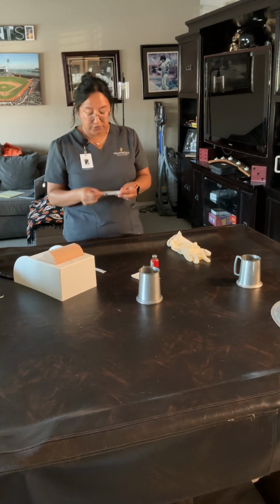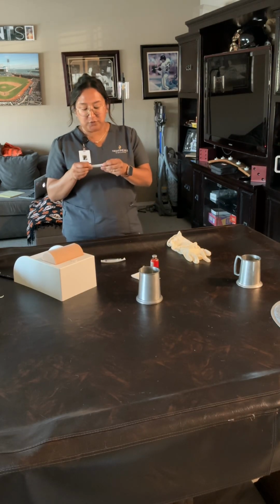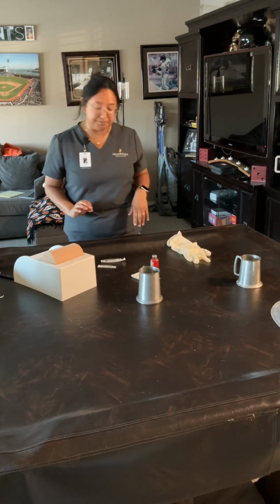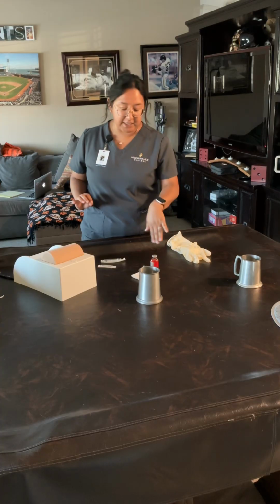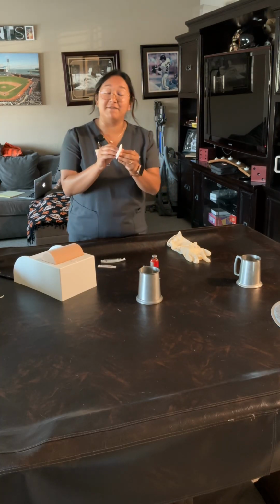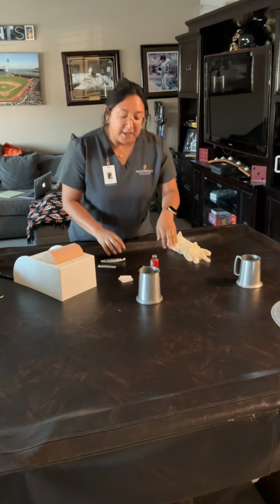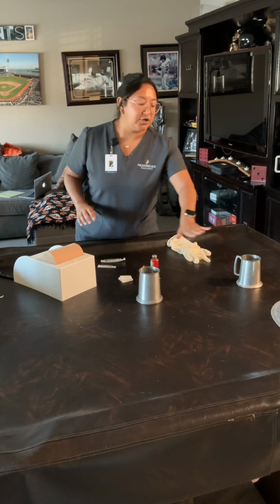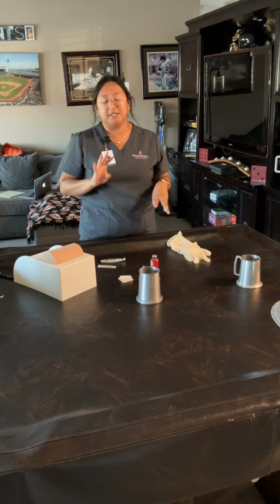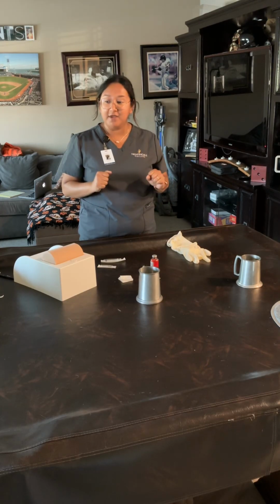I have a 3 milliliter syringe, and then a 22 gauge by 1 inch needle, and I have my gloves, my medication. I am out of alcohol pads, but I'm just using extra gauze as the alcohol. And these are my sharps container as well as my hand sanitizer. I am away right now traveling, so I'm just making the videos of what I have.